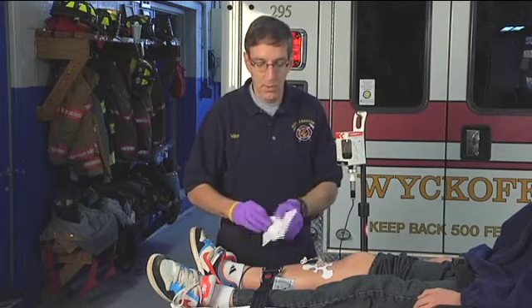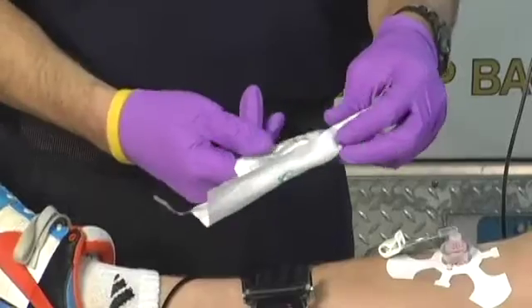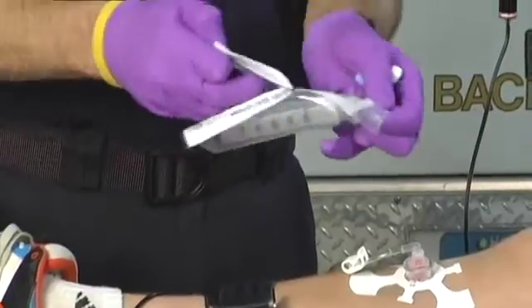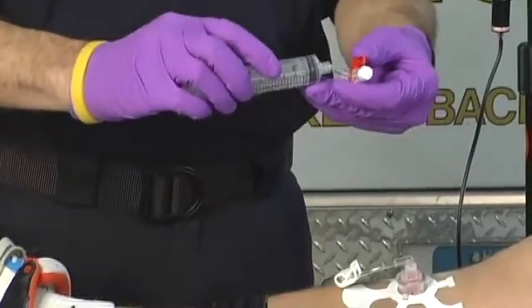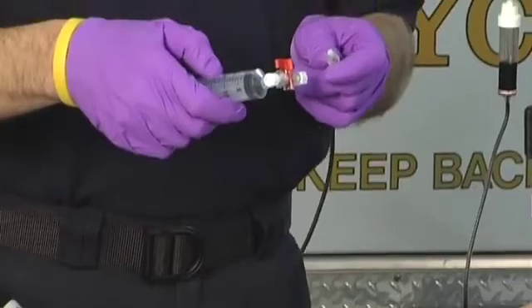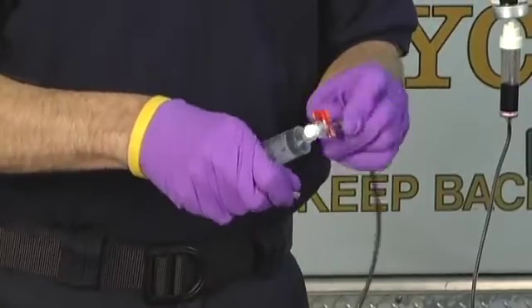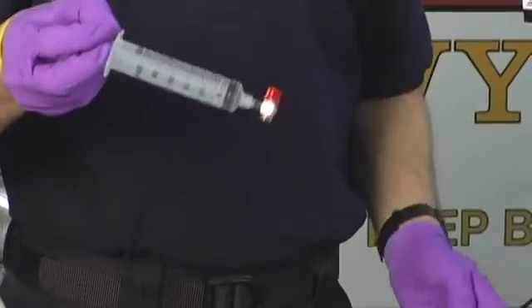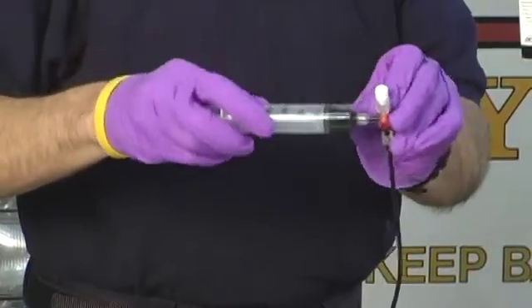We'll take the stopcock — which we've added to our supplies, as it doesn't come with the kit — and connect it to a 30 cc syringe. You could use a 30, 20, or 60 cc syringe; you just need a big syringe. We connect that to the stopcock, then connect the medication to one port of the stopcock, and pull medication into the syringe until we have it loaded to the tip of the stopcock.